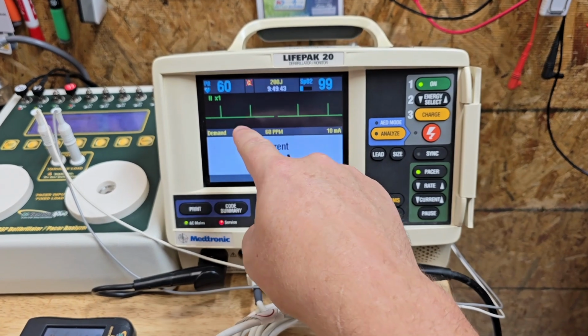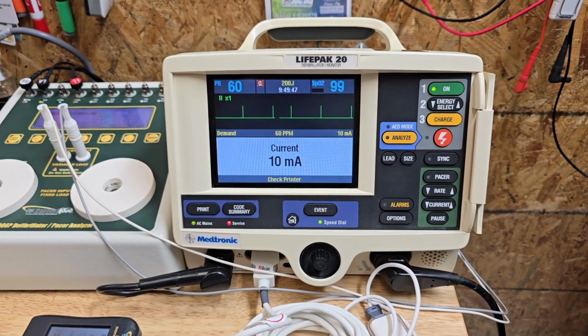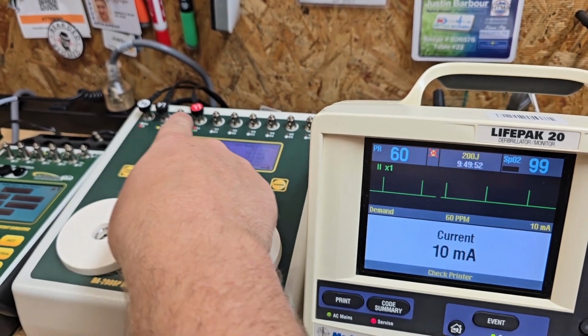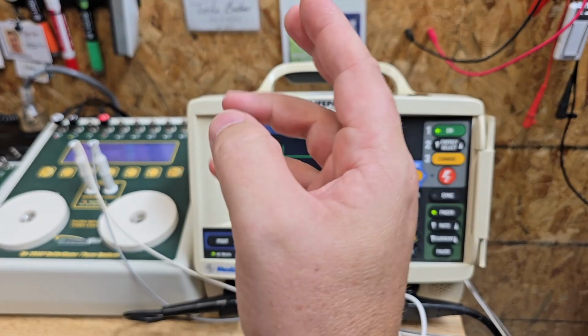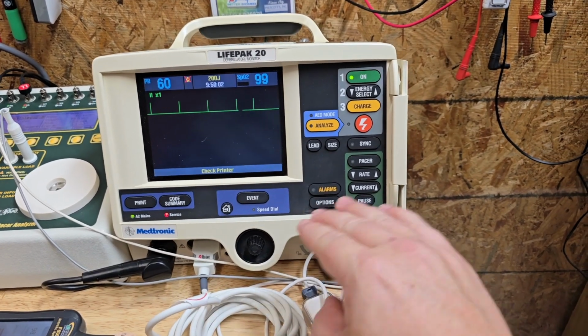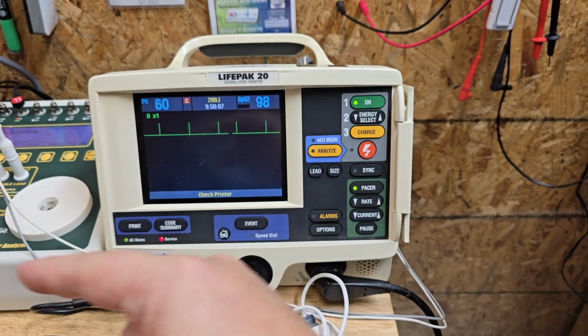And that refers to the heartbeat and when or if it needs to pace. Synchronous is when this guy right here is reading the heart rate, which I have up here with some ECG leads. If we set this guy for 60 and our patient is beating at 70, so it's above my threshold, then we don't need to pace. And you'll actually see that little pulse right there disappear.